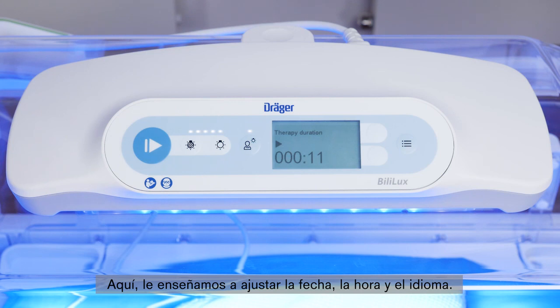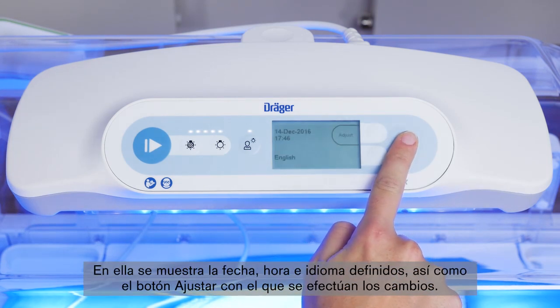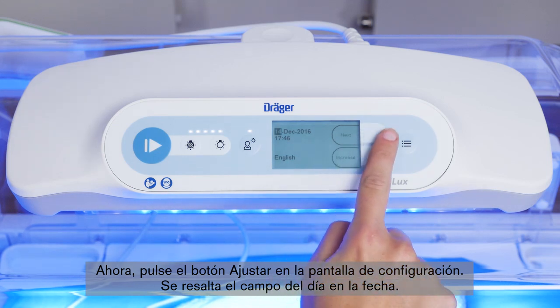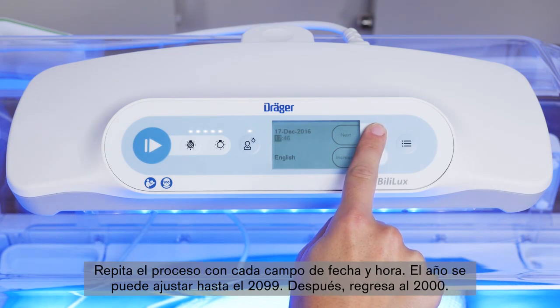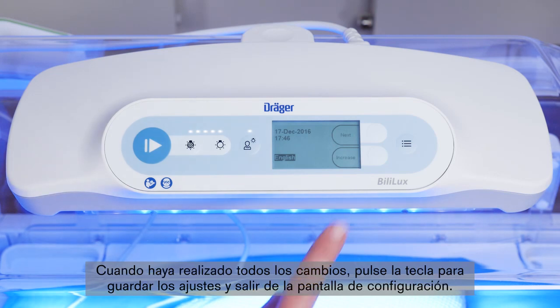Here we show you how to adjust the date, time, and language. Press the menu key until the configuration screen is displayed. It shows the currently set date and time, the language, and the adjust button used to make changes. Press the adjust button on the configuration screen — the day field in the date is highlighted. Press the increase button to adjust the day to the desired setting and press the next button to confirm and move to the next field. Repeat the process for each field in the date and time. The year can be adjusted until it reaches 2099, then it reverts to 2000. When all changes are complete, press the key to save the settings and exit the configuration screen.